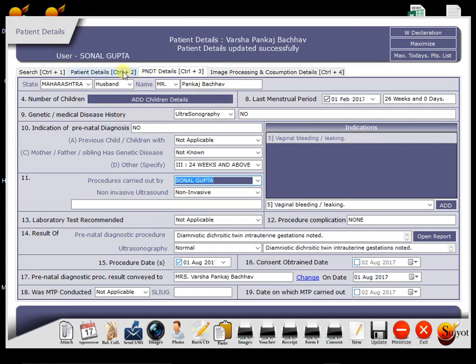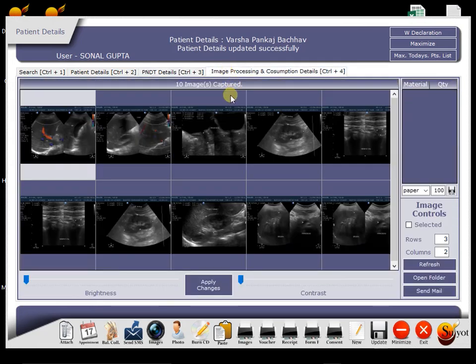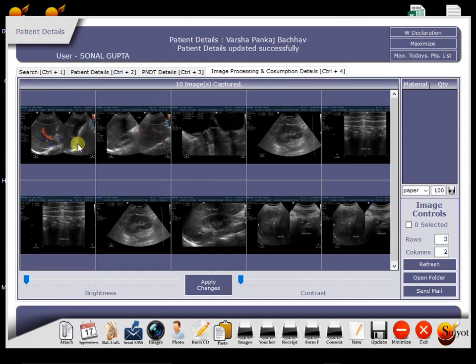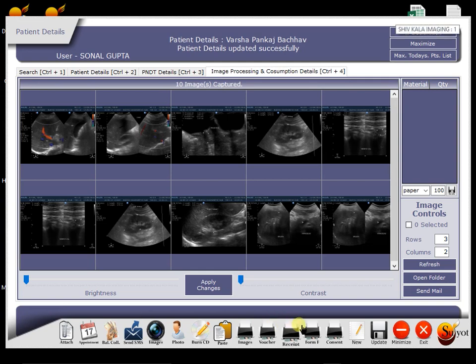Then patient comes to you for sonography. Now while doing sonography, you can also transfer the sonography images to your PC with the help of this image button. And by pressing this button, you can take image printout also.